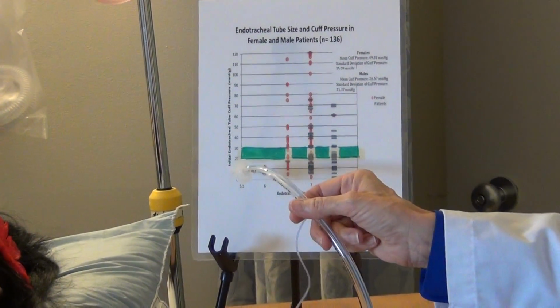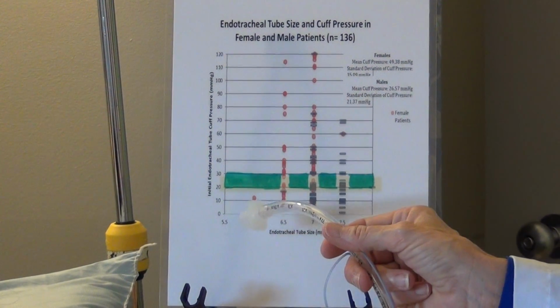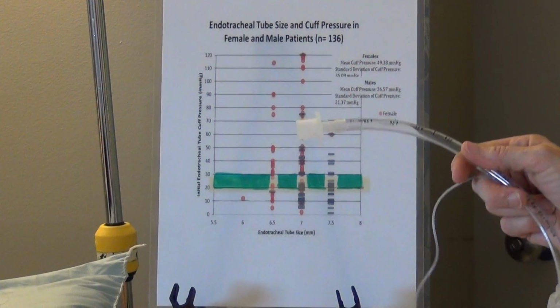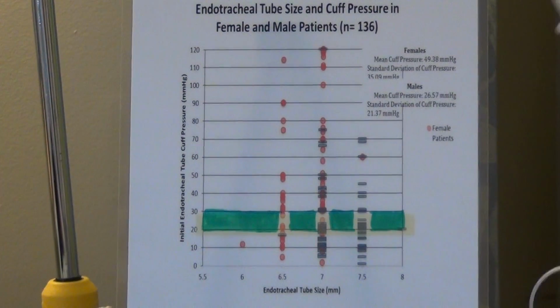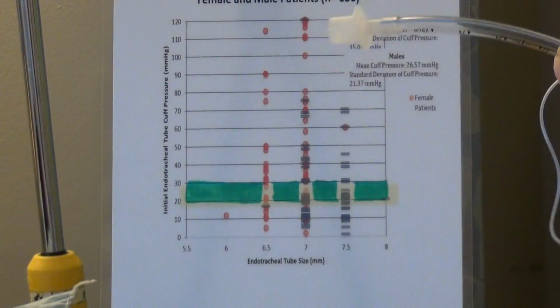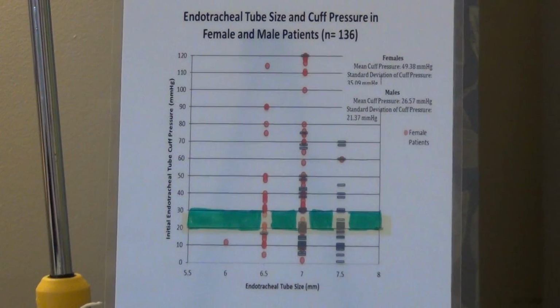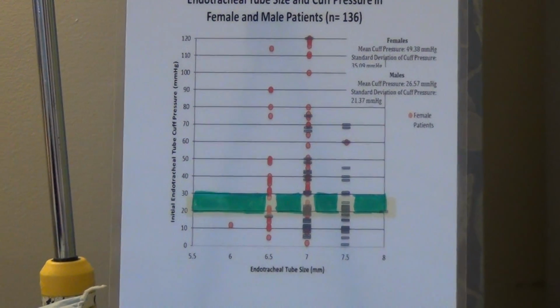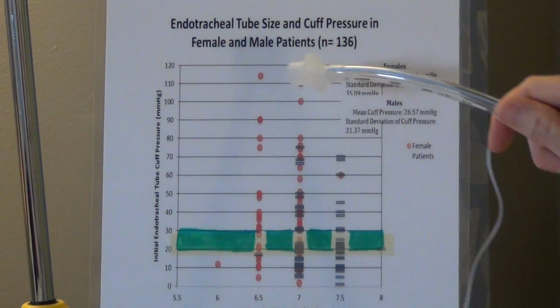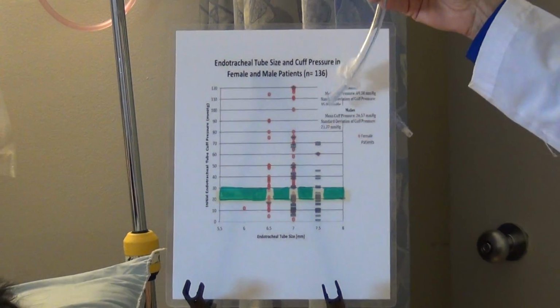This side is cuff pressure from 0 to 120. The bottom is endotracheal tube size from 5.5 to 8. What you can see immediately is that most of these pressures are outside of safe limits, being the green, between 20 and 30. In this study, the red dots are the women, and as you can see, the women have much higher pressures than men. And the men have lower pressures. Now, here in this one, there were 10 women with pressures greater than 100 and only 1 man.